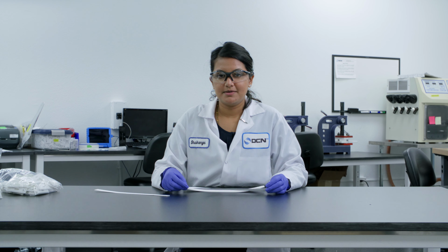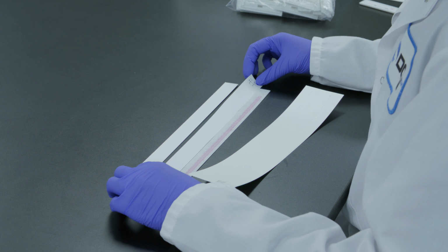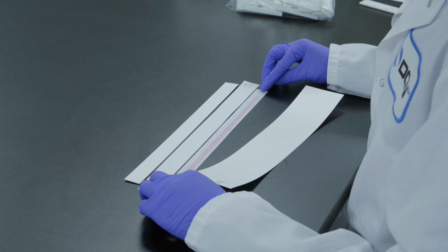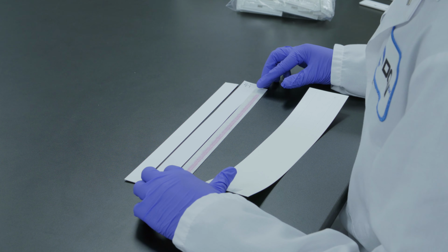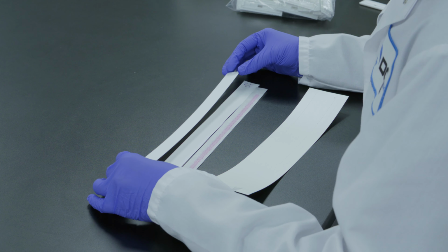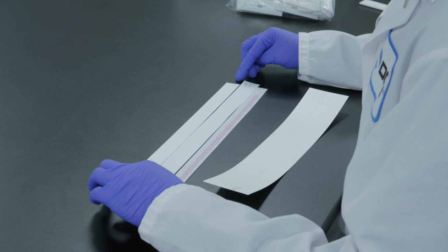So now it's time to put everything together. We have our dry dispensed reagents. We have our nitrocellulose membrane with our immobilized capture antibody. We have our conjugate pad sprayed with our detector antibody. And one more part of the lateral flow strip is the wick pad or the absorbent pad. This will allow the liquid to flow from the bottom to the top in a continuous fashion.